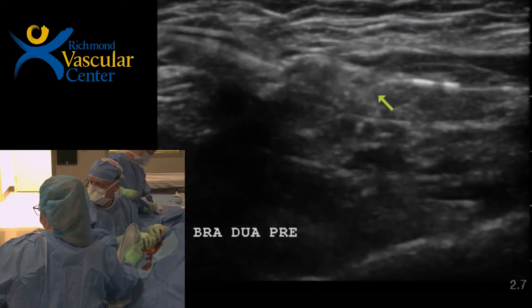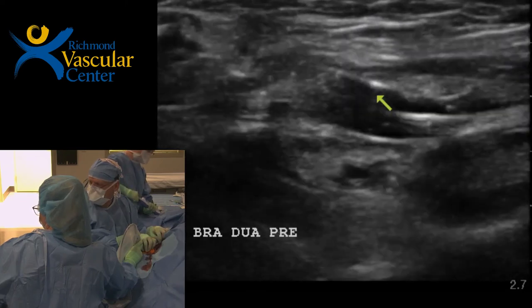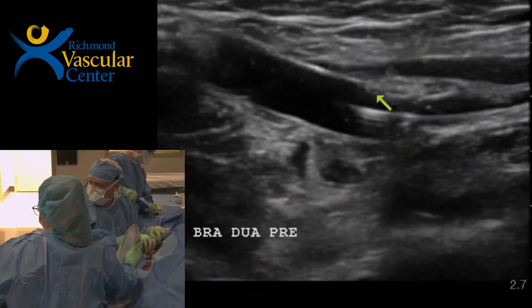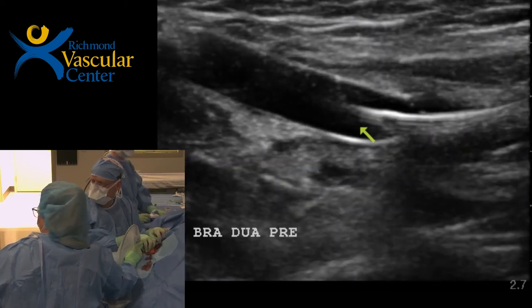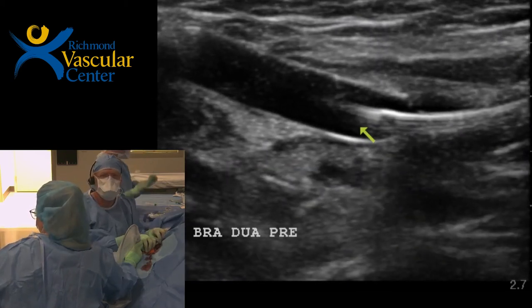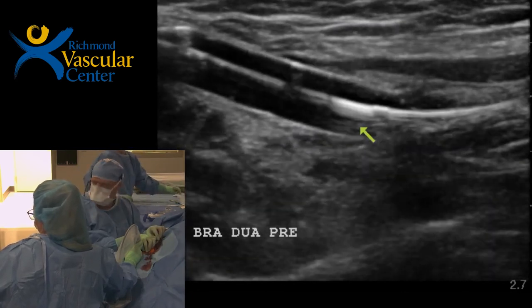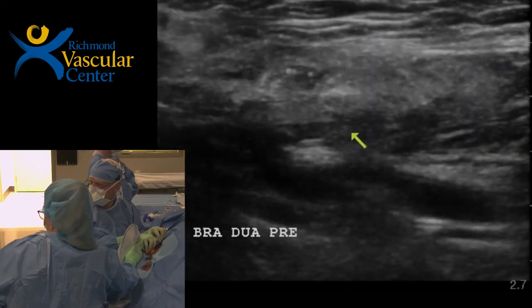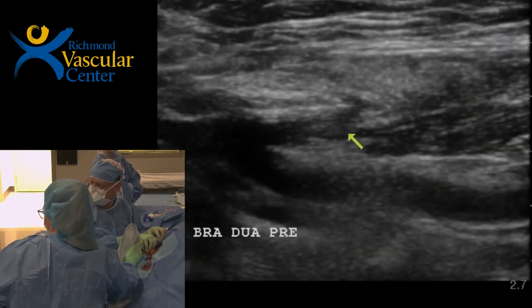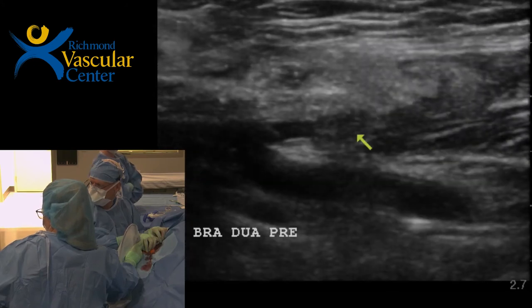Okay. I'm holding a little pressure to keep it from sliding out. Yeah, not going to be able to. All right, we'll just leave it there for a minute. So that's mostly dilating the perforating vein. It slipped almost completely out of the artery. When we show the proximal radial artery and the swing over, you can see. It's hard to see with the balloon right there. We're sort of occluding it.